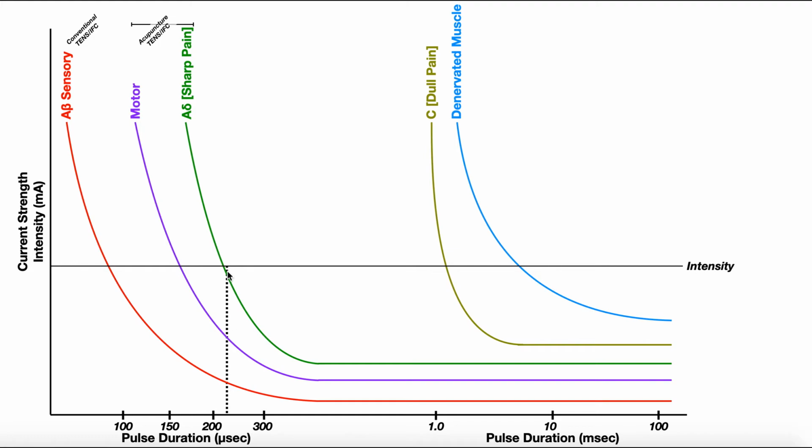But let's suppose you do the exact same pulse duration, the exact same frequency, and the exact same intensity on another patient. Did you notice what I did there? Look at the green curve. That's the first one. That's the second one. We've got some pretty significant crossing there on the green curve. So for this patient right here, how might their perception of this treatment differ from the first patient? Again, here was the first patient, here's our second patient.